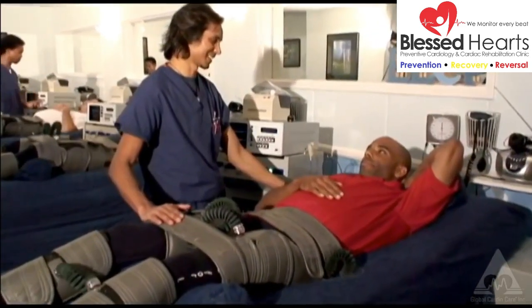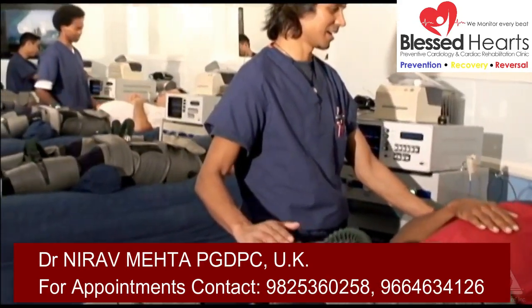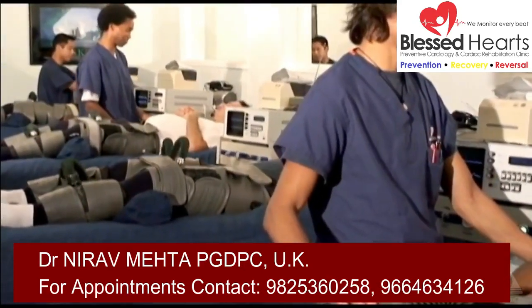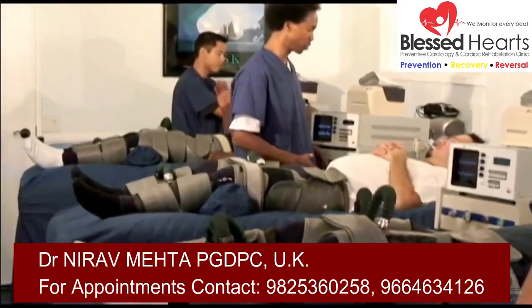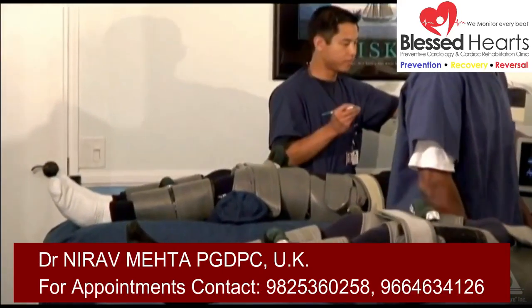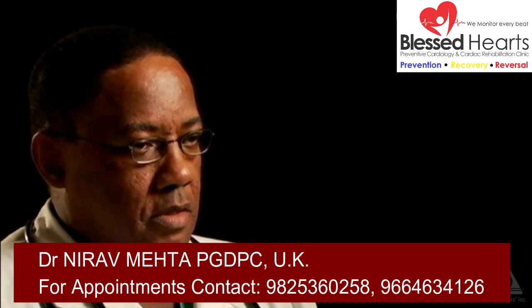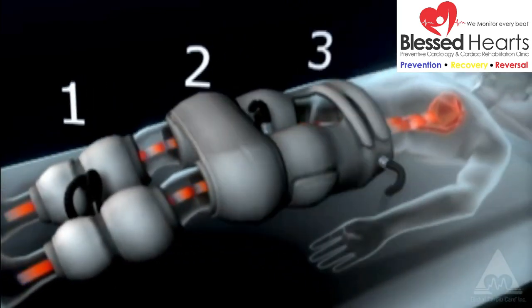Not all have had strokes or cardiovascular conditions, but I've had patients who had diabetes, which we also know is a risk factor for coronary heart disease as well as peripheral vascular disease. They have reduced therapy needs for insulin or oral agents if they are taking that for the control of their diabetes mellitus. It's my understanding that that occurs as a result of the increased blood supply that you see, also the weight loss that you see in these individuals who complete the course of EECP.